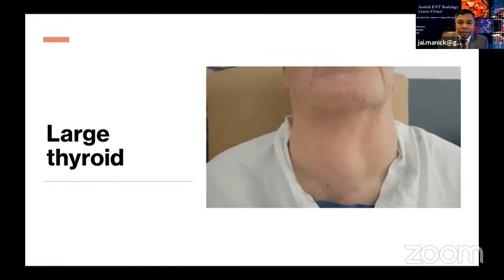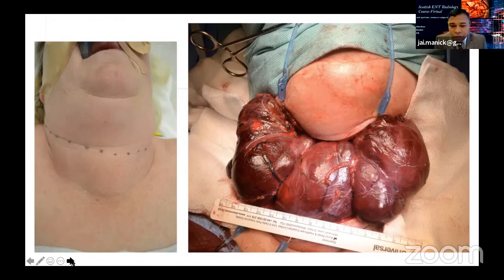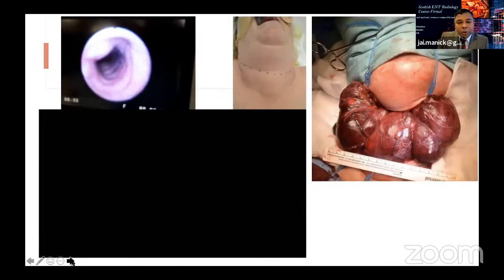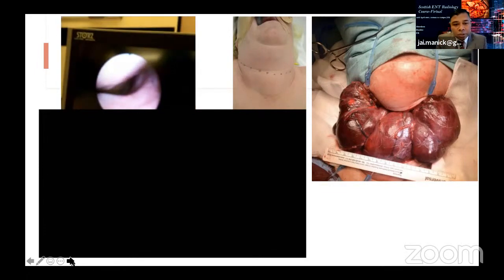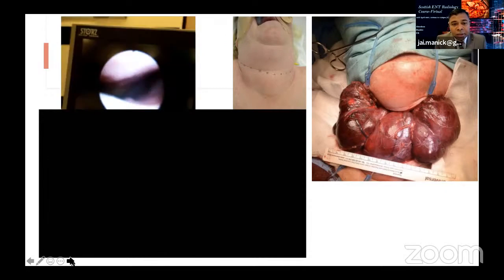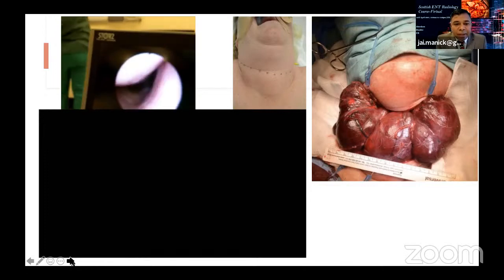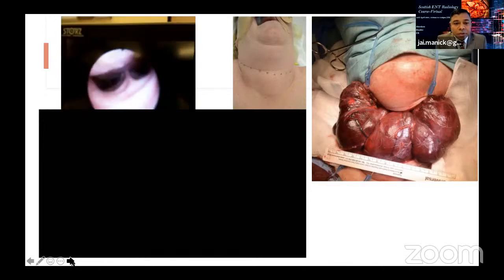So clearly, there are two concerns here. There are some concerns about the airway, and it's a large thyroid lump. So why do you need to do imaging? Anyway, you're going to remove this tumor. You can see that it's nearly half a foot, a 15 centimeter large thyroid lump. And the concerns are here. You can see on the top left-hand side, there's a fiber optic intubation of the trachea and the larynx. You can see anterior, posterior, kind of springing back. It's clearly a sign of tracheomalacia.